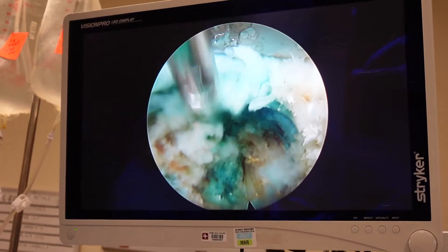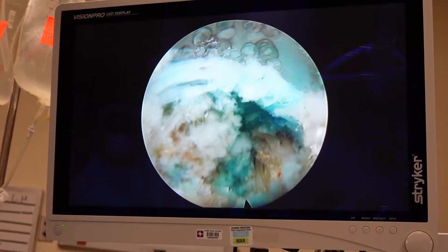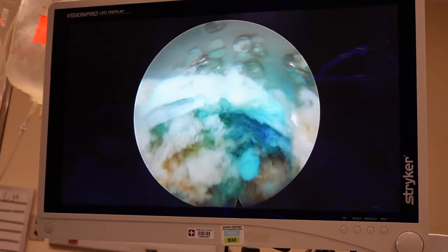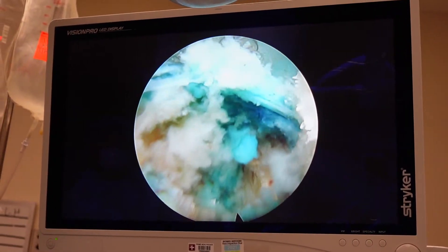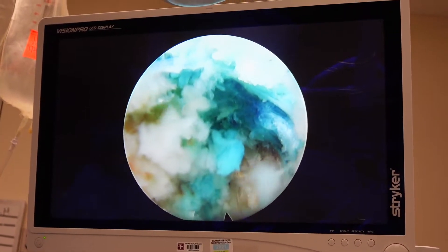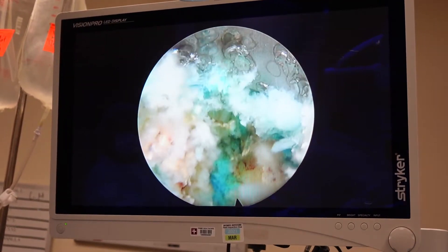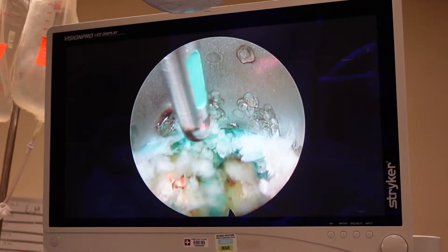You can see blood vessels starting to grow into it — that's why it's called granulation tissue. The nerve is right above it; there's a tiger stripe going straight down. That blood vessel right there is in the annulus trying to heal. Now you can see that the blue posteriorly is starting to disappear, and you only have blue down in the middle — consistent with the annular tear, because it should only be blue on the outside if there is a tear leading toward it.